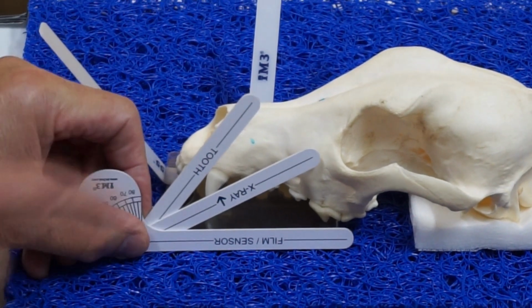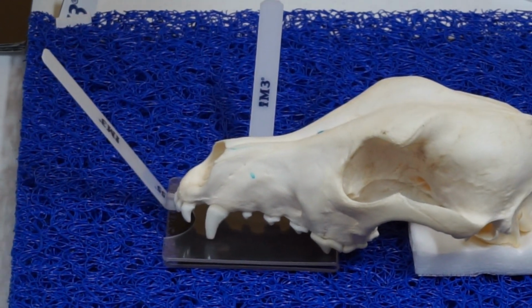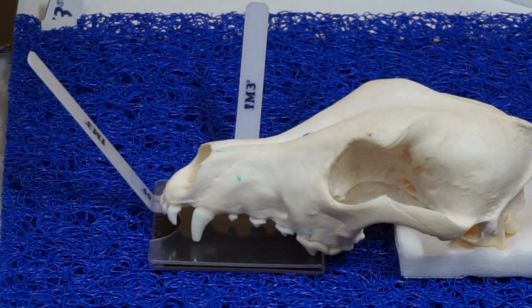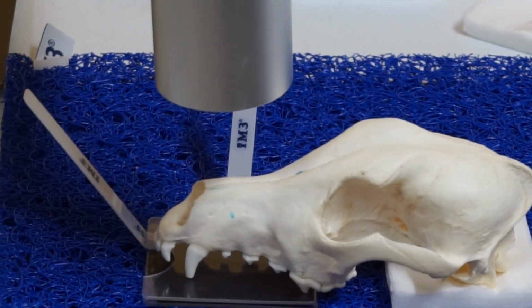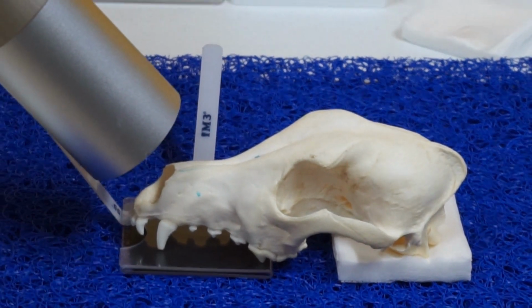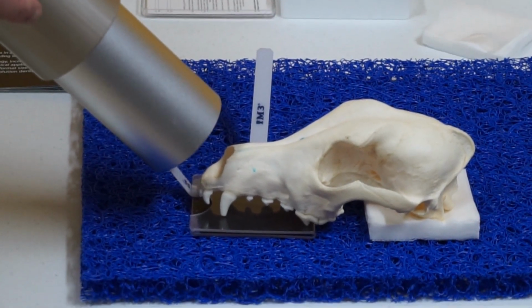So you can do that, or you can use another tool, which is another positioning tool for your X-ray source. So normally I would start at right angles to the plate, and then I'll drop to about 35 degrees to get a one-to-one image of the canines, both those maxillary canines on the film.